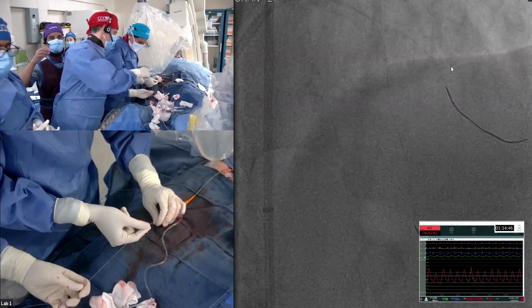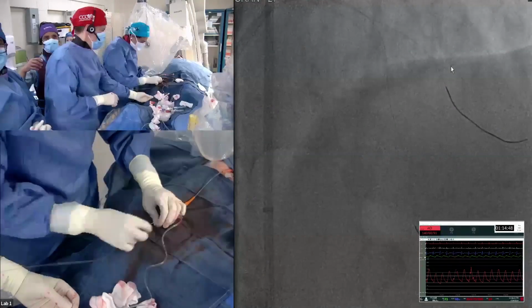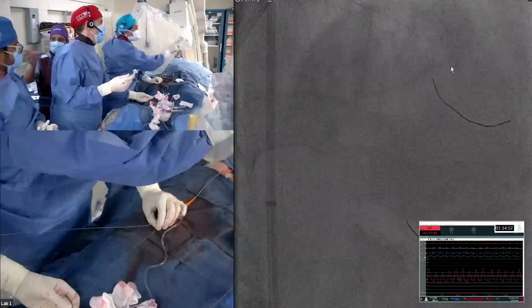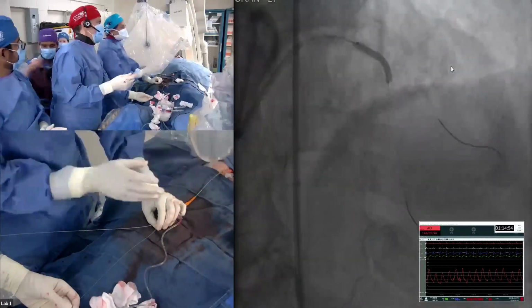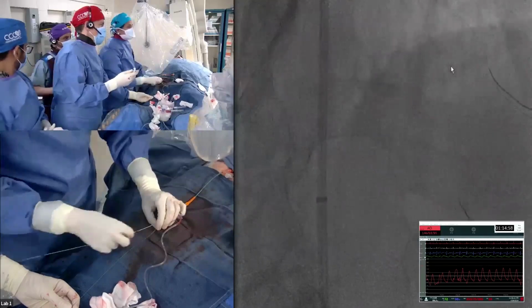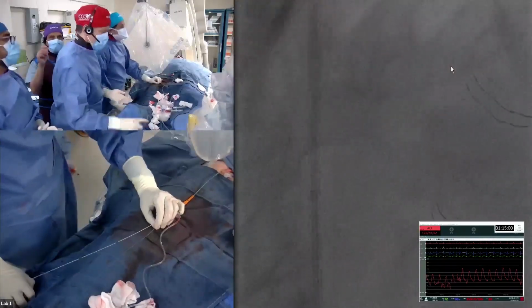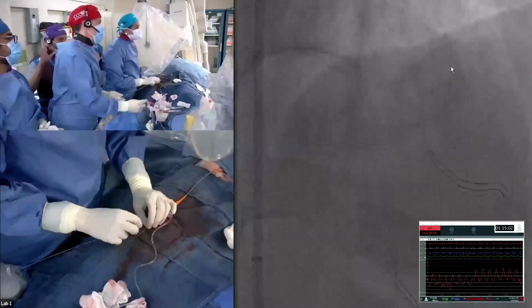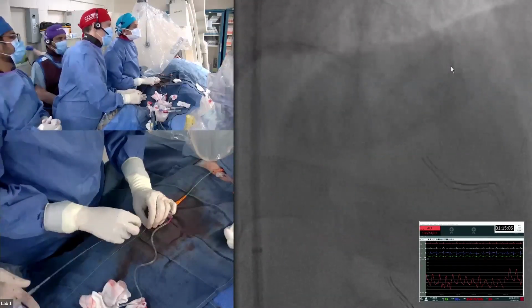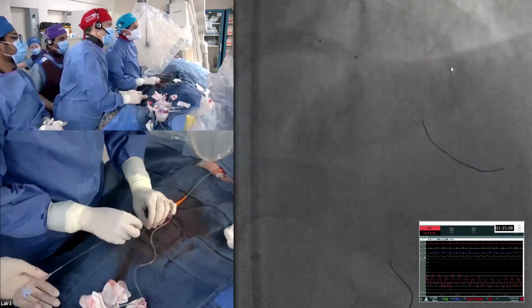Okay. What did you get, Dr. Kinney? You opened the... No, we dilated. You look at here. We dilated, looking so good. I think it's just time to stent it. No, what I wanted to do, Okay, is see how the diagonal opens up. I think this whole case was the diagonal. Yes, and that's the key. So how it opens up, then we are ready actually. We are ready for a long time.